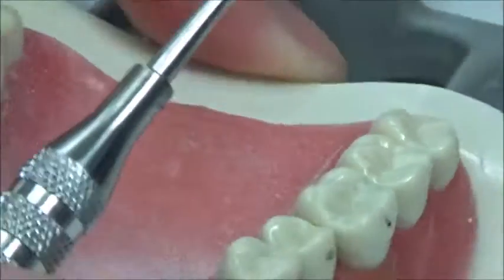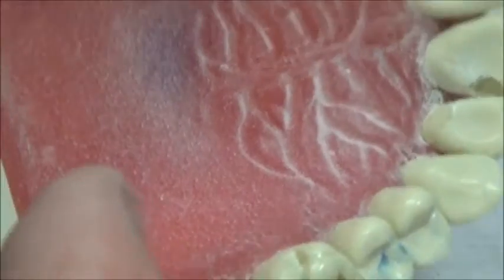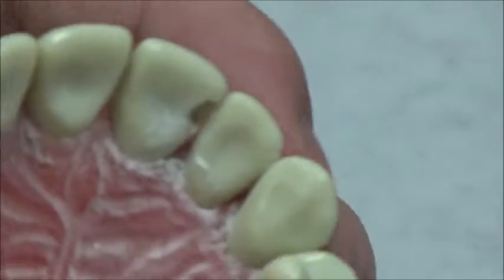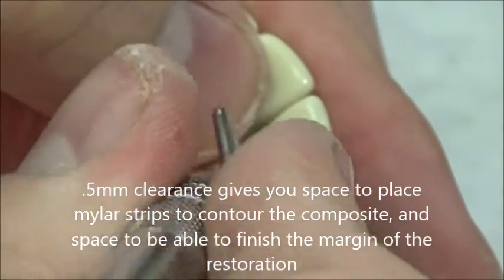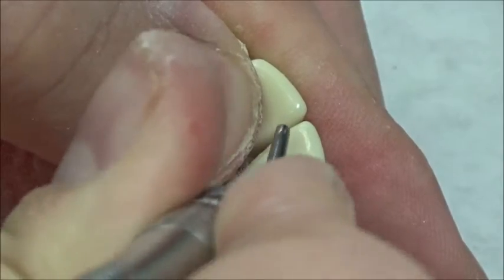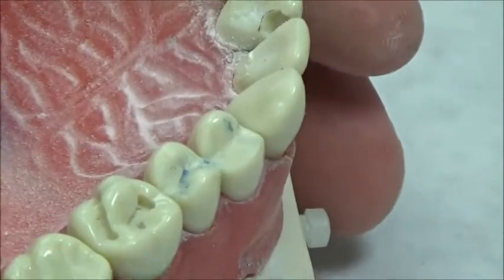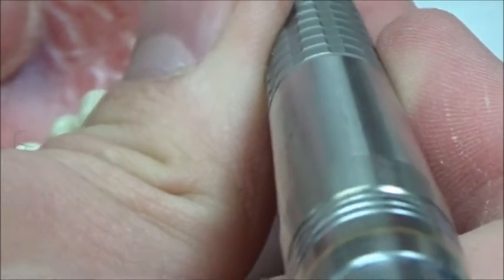If you want to check for clearance, take the wedge out and check. We're looking for pretty much 0.5 millimeters of clearance — you want to see a little bit of daylight peeking through. You can check using the IPC, which is 0.5 millimeters, so that's one way to verify you have adequate clearance.